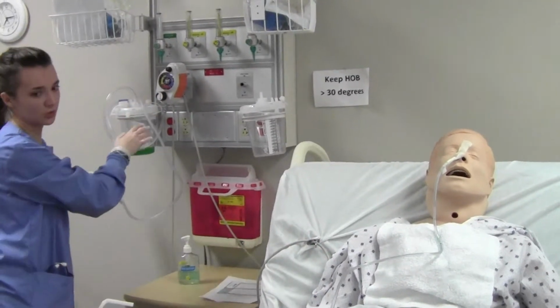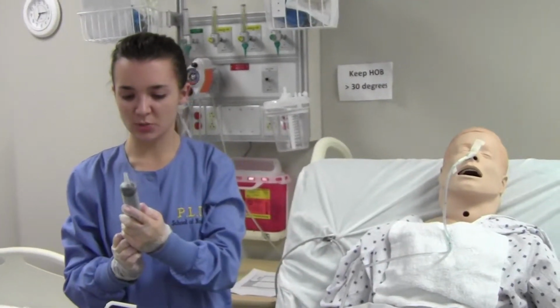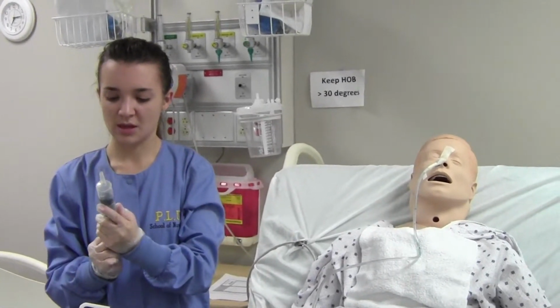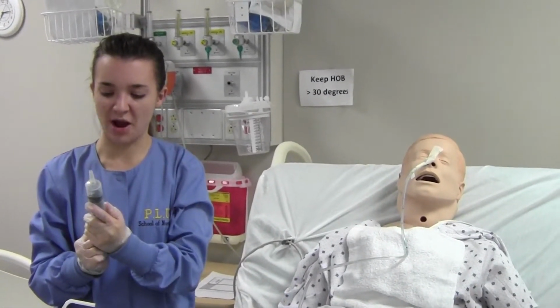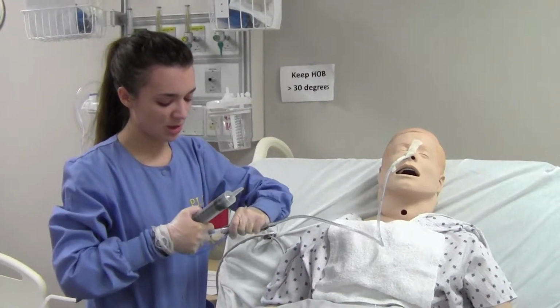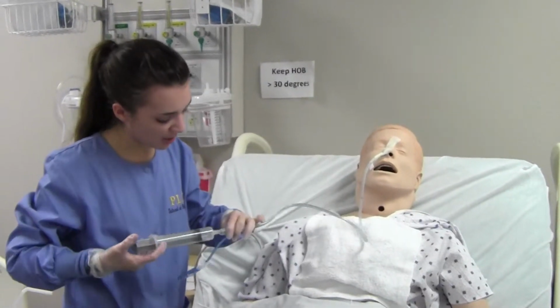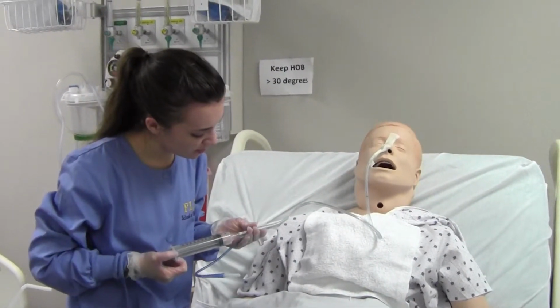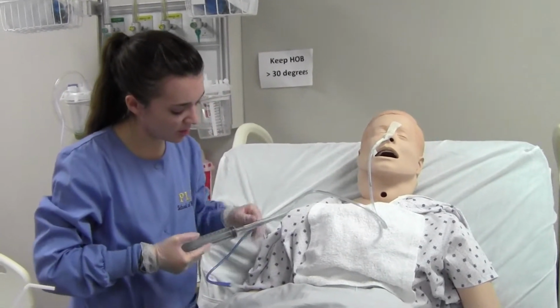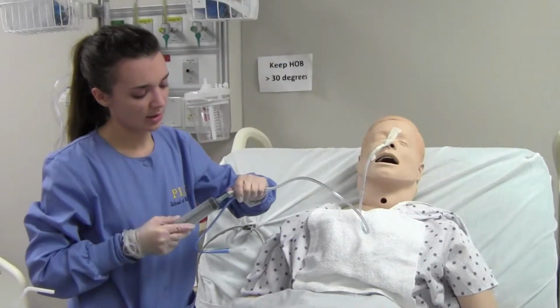I'm going to do what is called the whoosh test, just to make sure. I'm going to do between 10 and 20 cc's. Nowadays, this isn't in practice, though, so I realize that. But we're just doing it for this procedure. So I'm going to pull this out, place this in. I'm going to push in some air. I hear some gurgling for our whoosh test in your stomach, so there we go. And I'm going to lift this up.